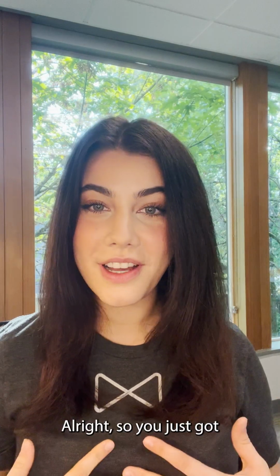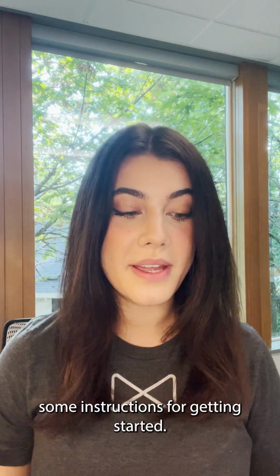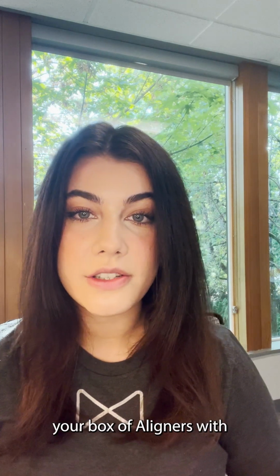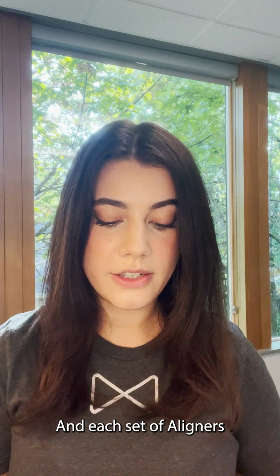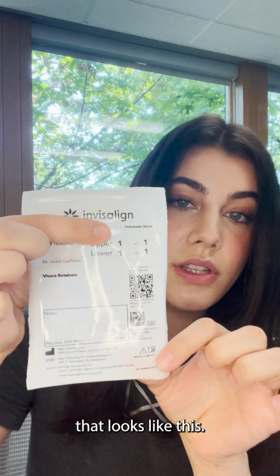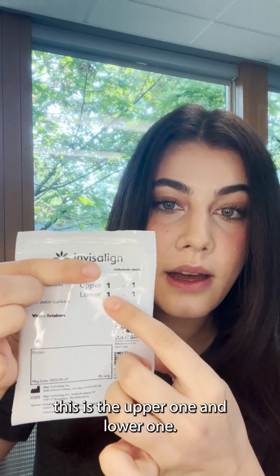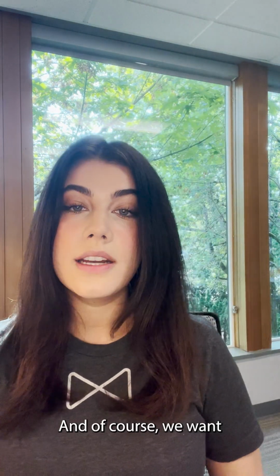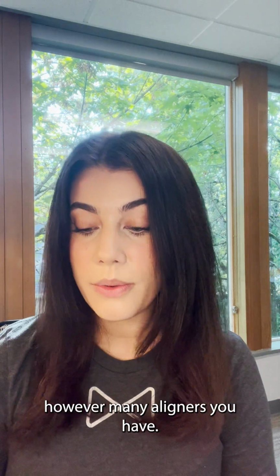All right, so you just got started with Invisalign. Let's go ahead and review some instructions for getting started. So you're gonna get your box of aligners with however many you have made, and each set of aligners is going to come in a package that looks like this. And then you can see here, this is the upper one and lower one, so your first set of aligners. And of course, we want you to go in order 1 through however many aligners you have.